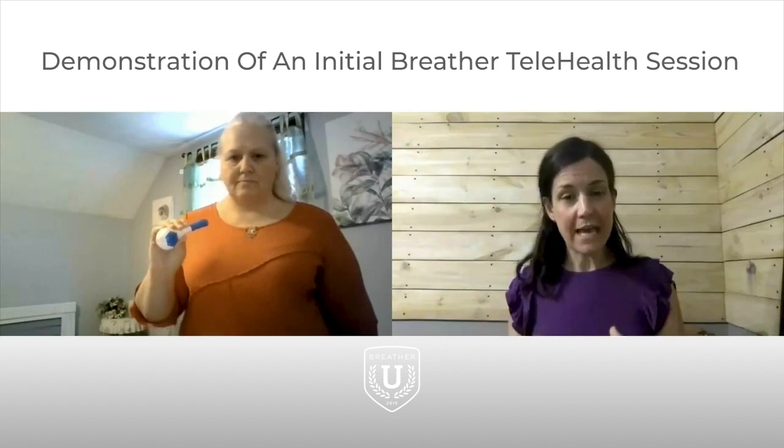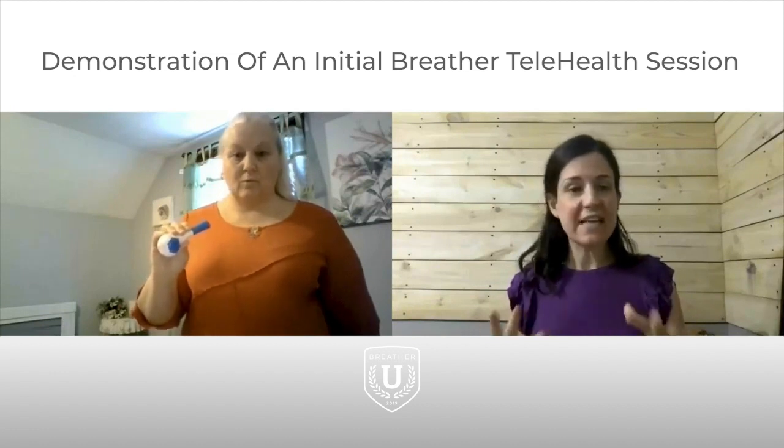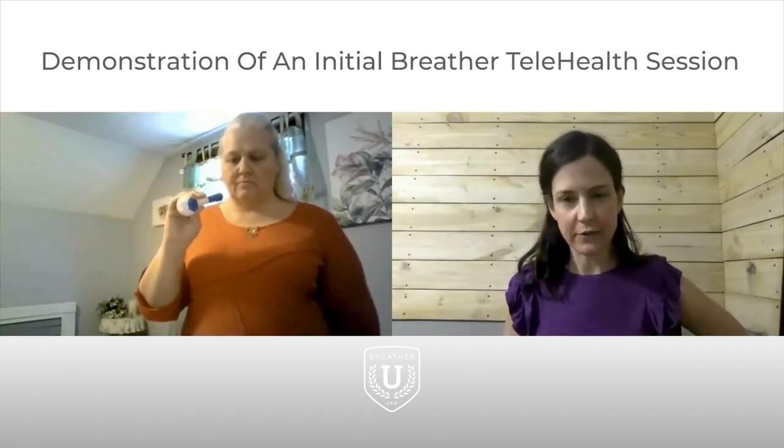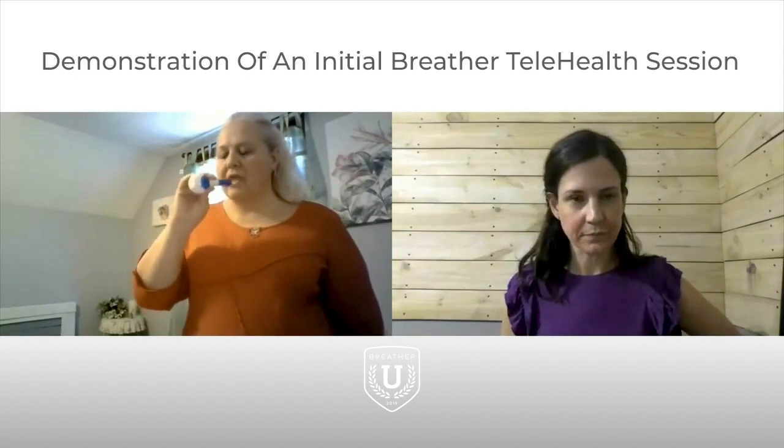I'm okay. Okay. See if you can do 10 reps. If you get to 7 or 8 and you need to stop, just stop and we'll know that that's a good stopping place for you. But shoot for 10, see how it feels. Okay.